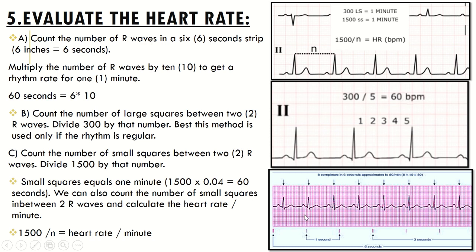One more thing: in some papers the 6-second strip won't be mentioned. In that case it is very difficult to count the 6-second strip and then calculate the heart rate, so you can't perform this method.